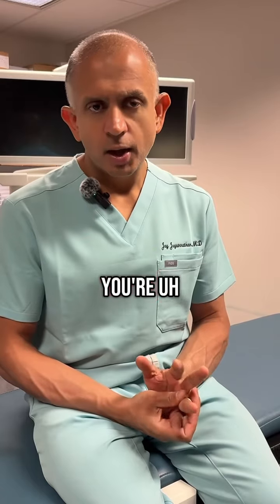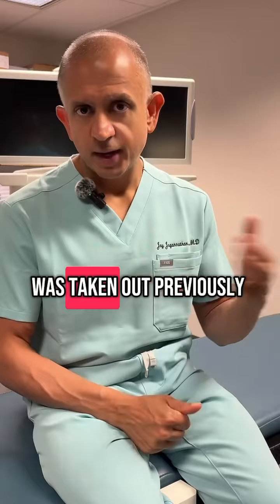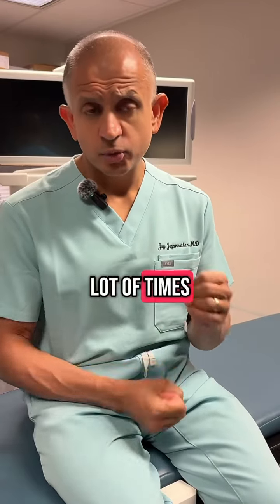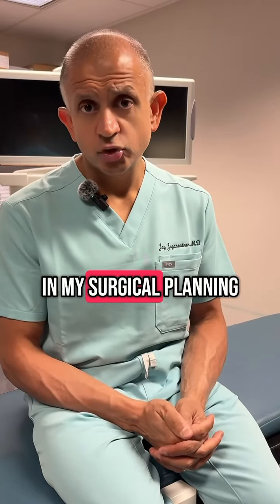For example, when I'm doing revision surgery, I oftentimes will get a CT because it tells me how much of the bone was taken out previously. When I'm trying to evaluate things like screws and cages, a CT a lot of times will tell me subtle things within the bone itself that'll help me in my surgical planning.